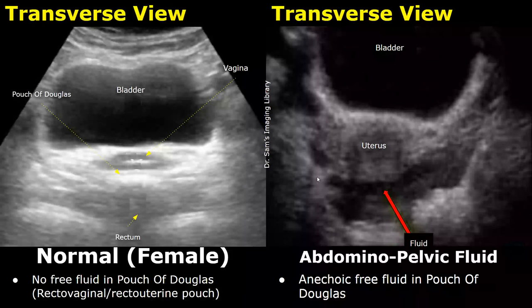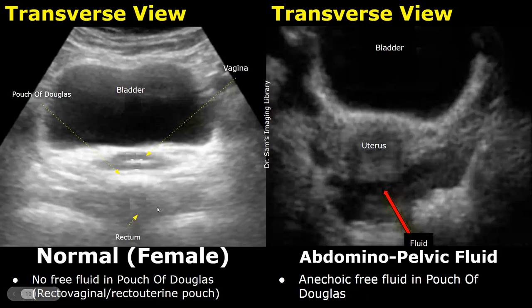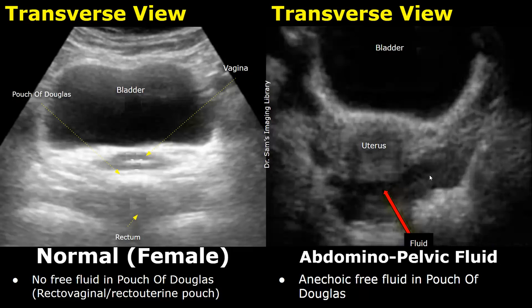The pelvic region is usually scanned in a transverse view to check for free fluid. In a normal image of a female patient, the anechoic fluid structure is the bladder. This is the vagina, and down here is the rectum. The space between the uterus or vagina and the rectum is known as the pouch of Douglas, or rectovaginal or recto-uterine pouch. Free fluid is usually found at this location — in this image we can see a significant amount of free fluid in the pouch of Douglas, seen behind the uterus as an anechoic fluid collection with some complexity.